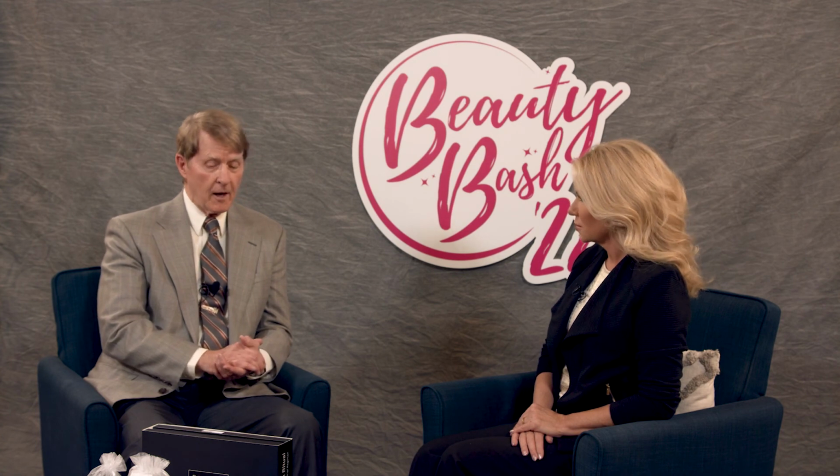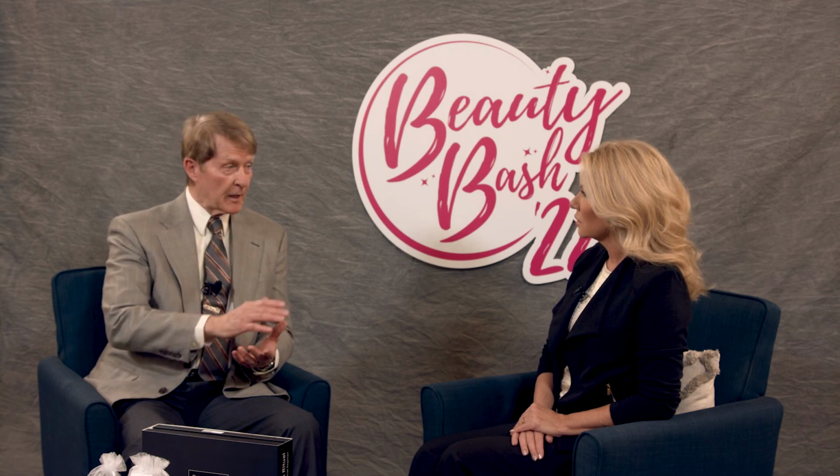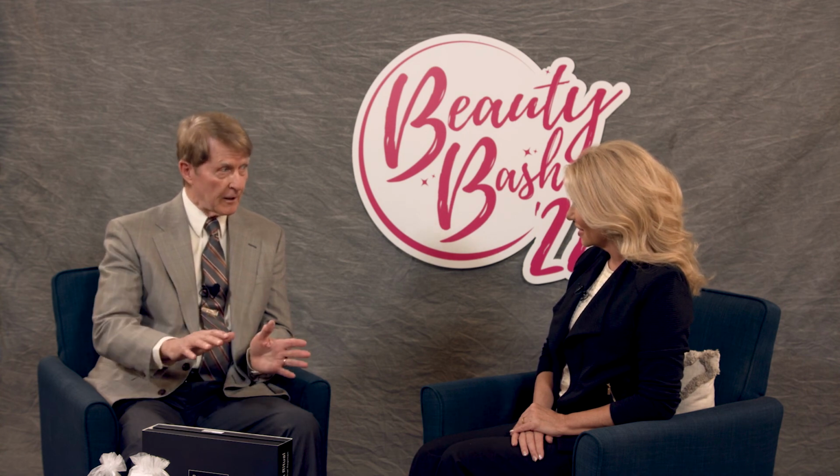What parts of the body can you use that on? Is it just for the face? Well, no. In fact, I had the back of my hand treated just a couple of weeks ago. We have a little scanner that will actually fit the back of the hand, and that's what was in the video you saw. And if you make these little injuries in the skin every month for about 2 or 3 times, it's amazing what will happen to the skin. The brown spots kind of fade out, the skin gets thicker and just looks more healthy.